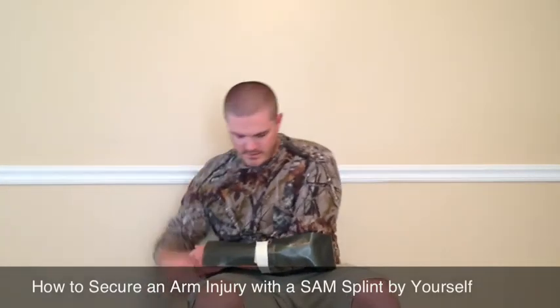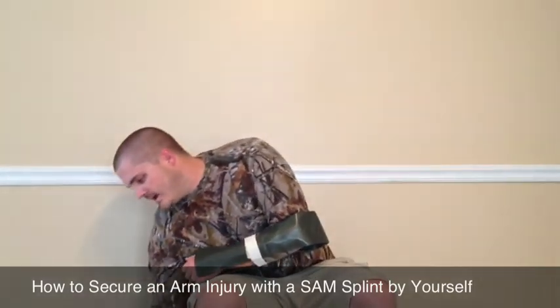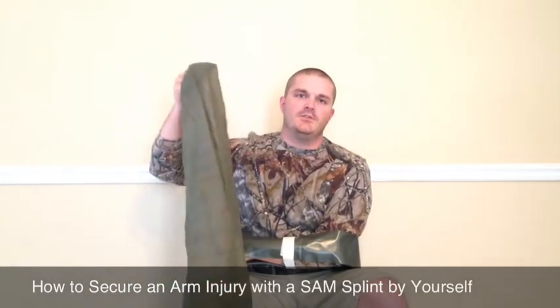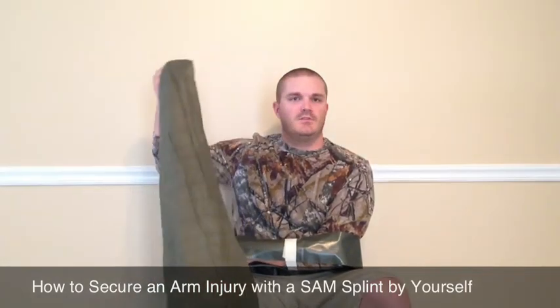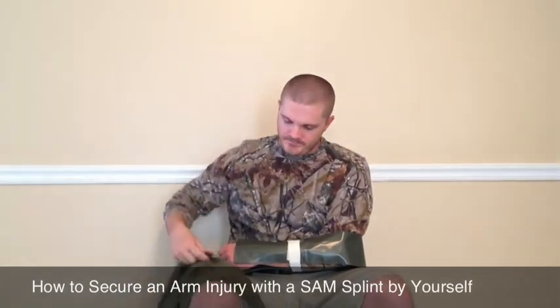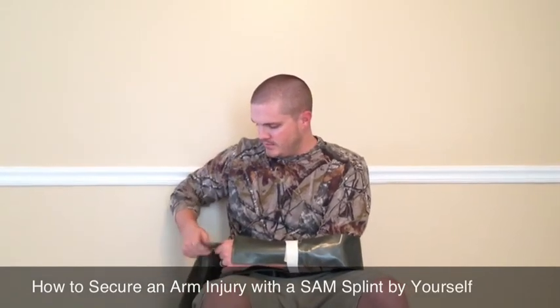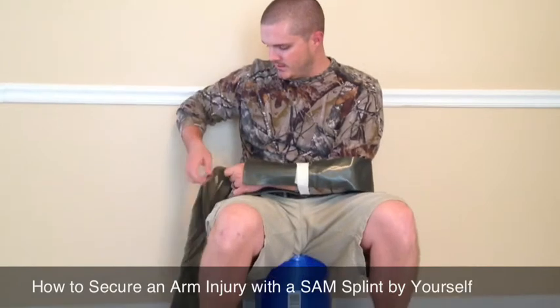Now that arm is going to be secured, and for even added protection from further injuring yourself, you can use a cravat — also called a triangular bandage. Tie the two ends together and make a sling for yourself.